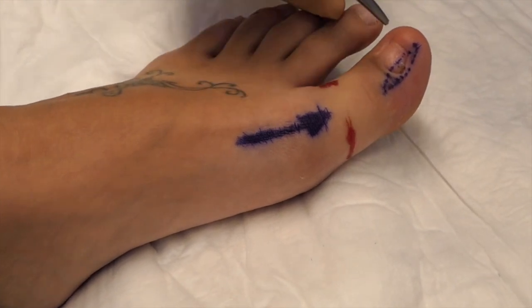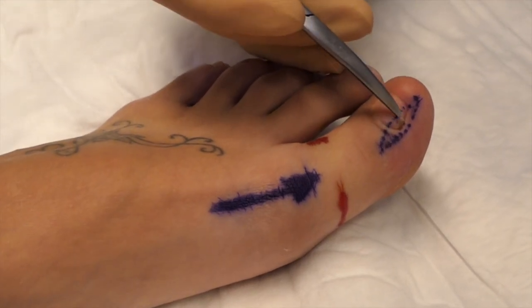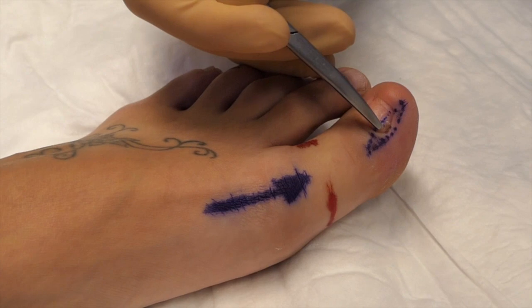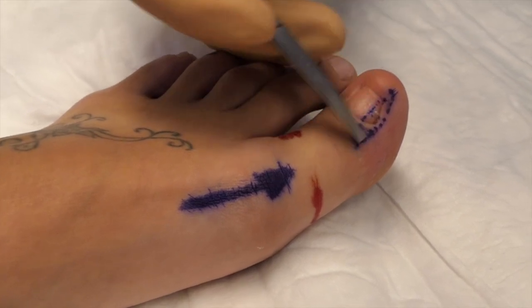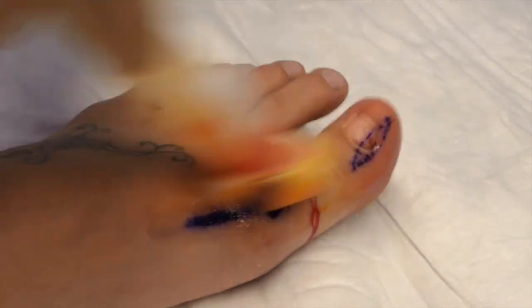This lady has had previous nail surgery. She's already had a total nail avulsion with phenolization, but she's got a little bit of regrowth just in the medial side. So we could re-phenolize, but in this instance we're going to do an incisional technique, and this is the Winograd. Start off with some skin prep.